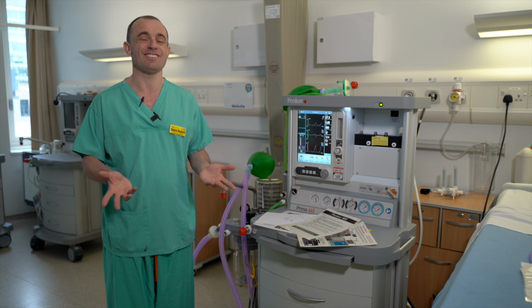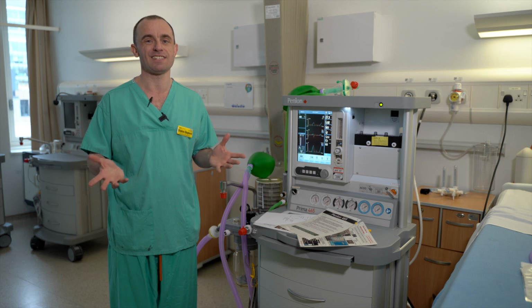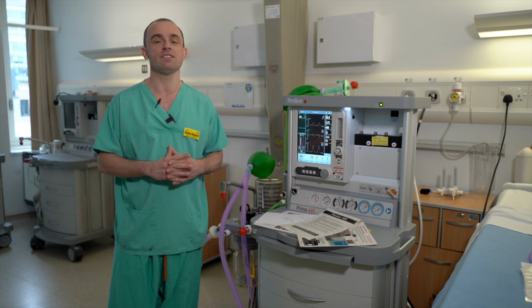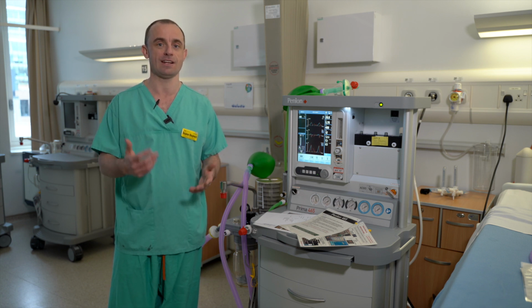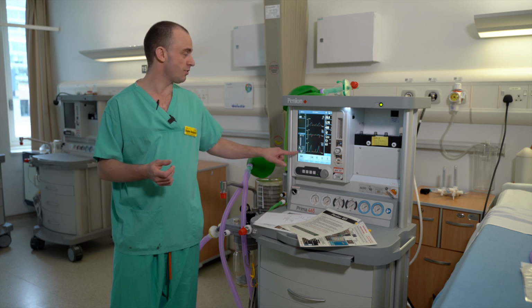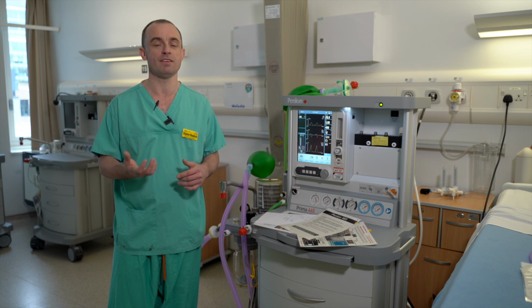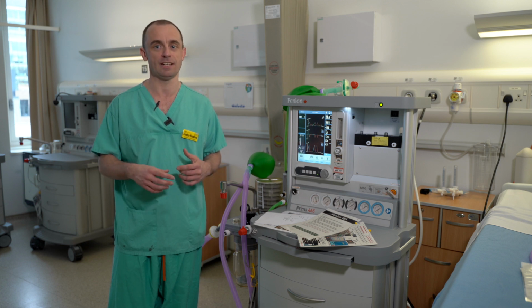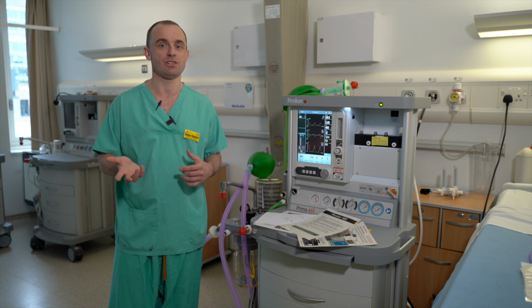For airway interventions like suctioning, the minute volume being around the same as the gas flow should be sufficient for you to fill the circuit. But for interventions where there's going to be repeated suctioning, such as physiotherapy-led airway clearance, it's recommended that you increase the gas flow up to 15 or 20, depending upon what the minute volume is, and then that will give you some space to fill the circuit while that intervention is happening. You can reduce that gas flow back down once the procedure is complete.